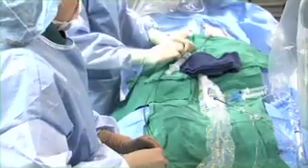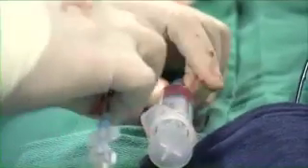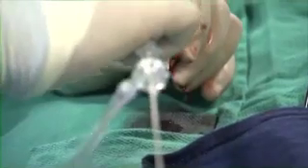So now we'll put in the wire, and we're going to clear the catheter of any bubbles that's possible there, so we don't want any embolization. That's what I'm doing right now. Can you focus on my hands, please? And we're going to be ready to deliver the device going inside the catheter. Flush. So this is the device mounted in its catheter, which I'm going to advance.